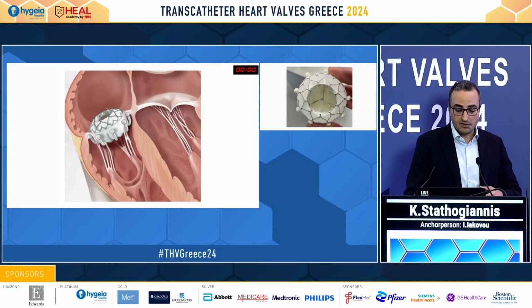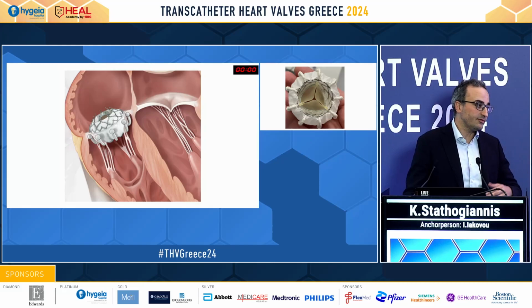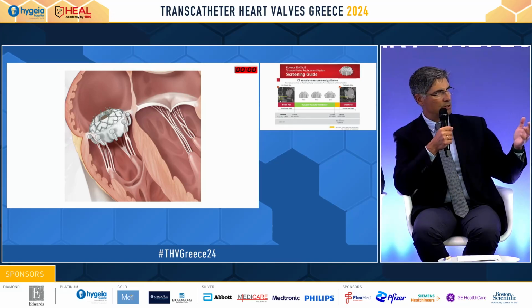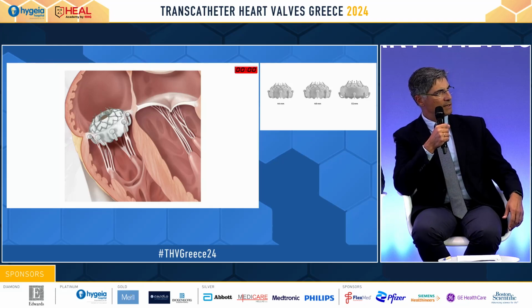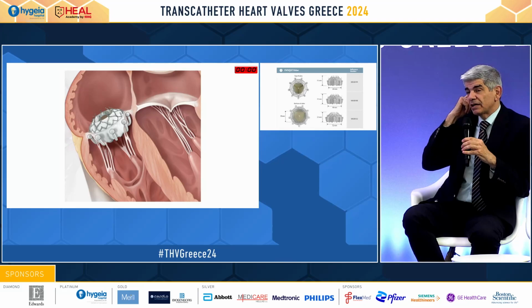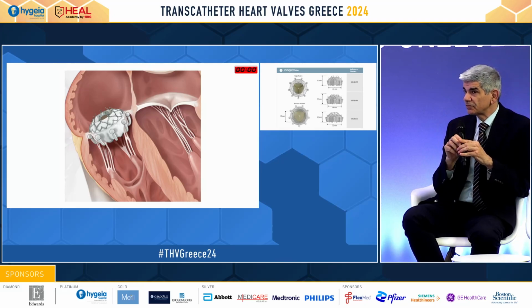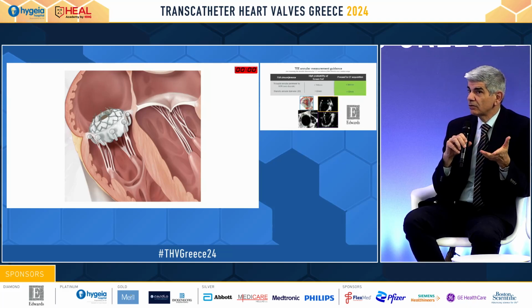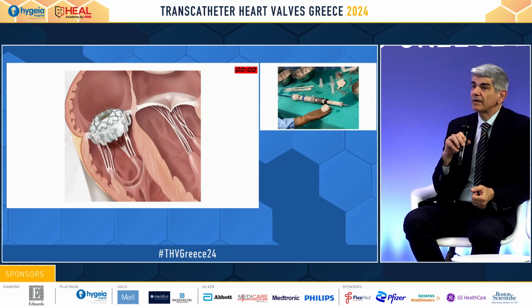Okay. But there seems to be a positive effect, but it's too soon to say anything right now. Clinically, they are better. Of course, echocardiography. Did you have an echocardiography in these patients? Of course, we also had a discharge echo. We didn't have any issues pertaining to right ventricular dysfunction on clinical grounds, and she went home, if I recall well, at 4 days of hospital stay.